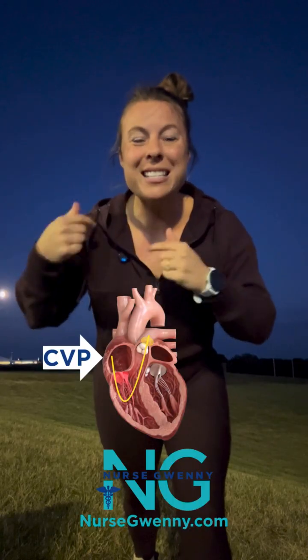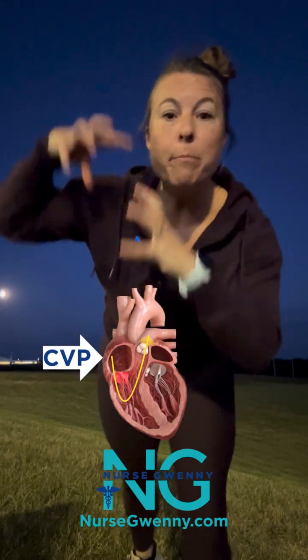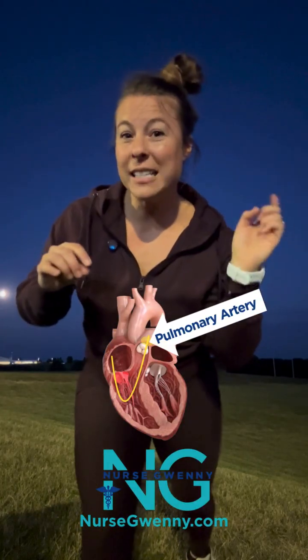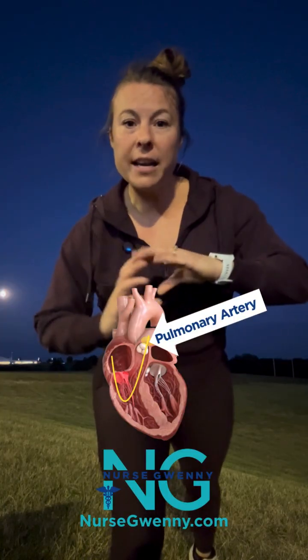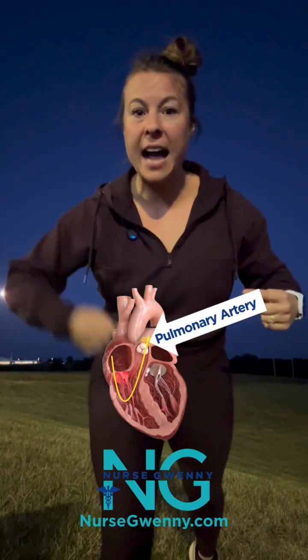So it floats into the right side of the heart, and it actually has two spots where it measures pressure. One of those openings that is measuring the pressure sits in the right atrium. We're going to call that our CVP, our central venous pressure, right? And that's going to indicate our preload, how much pressure of blood is coming back to the right side of the heart. Then the second pressure sensor is on the very tip of the catheter, which is going to hang out in the pulmonary artery. That's the big artery that comes out of the right ventricle and sends blood down to the pulmonary vasculature.